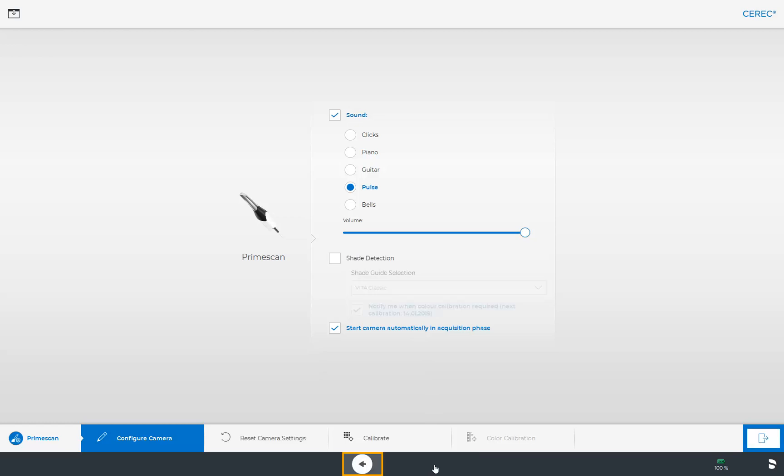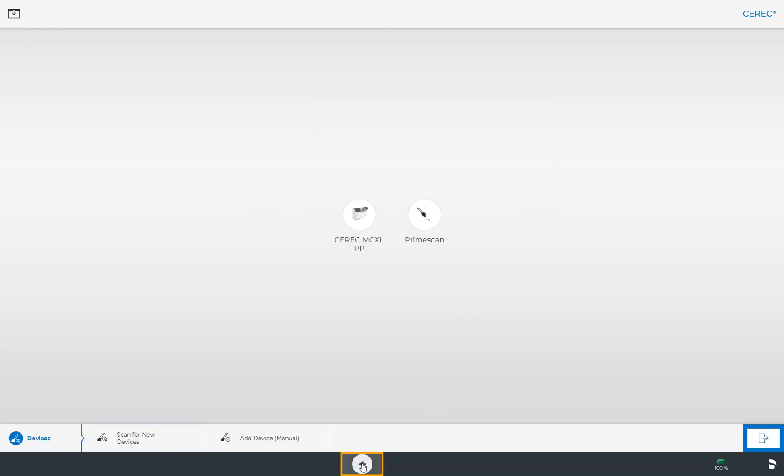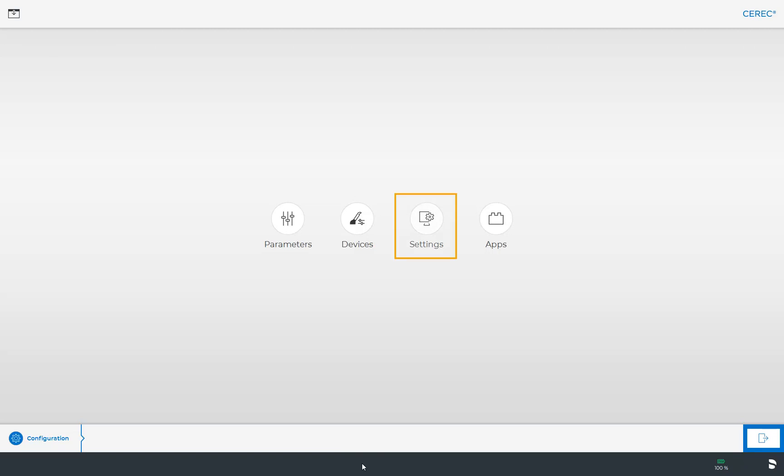Next, we go back two steps and look at the third submenu under Configurations, the Settings.